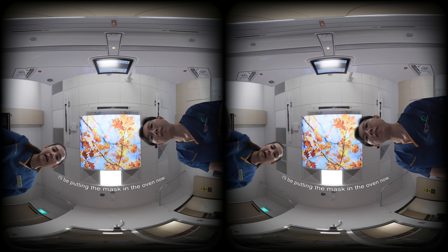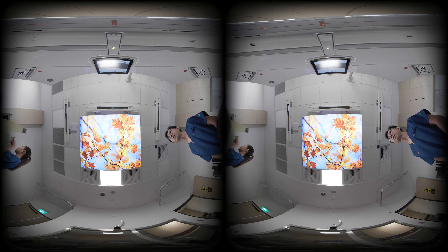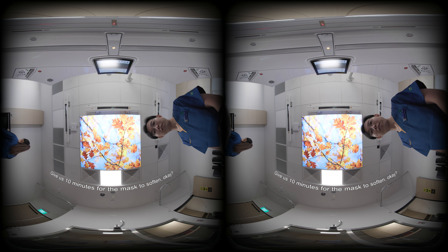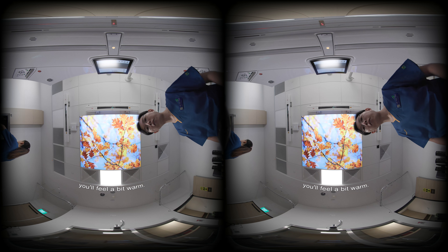I'll be putting the mask in the oven now. Give us 10 minutes for the mask to soften. The mask is ready. I'm going to take it out for you, but first let it cool down a little bit. You'll feel a bit warm.